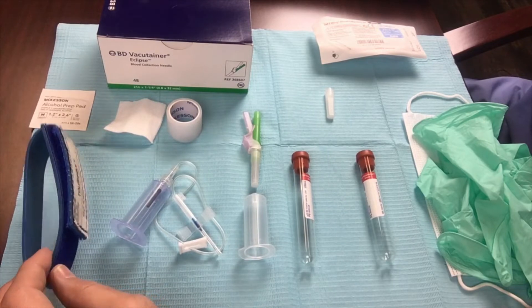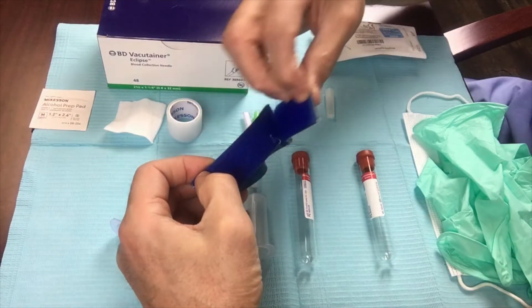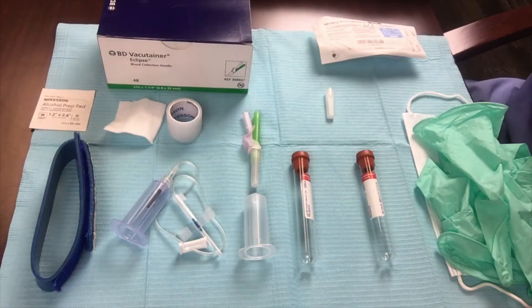The first thing I want to discuss is a tourniquet — a latex-free tourniquet. I use one that has a velcro strap. It secures nicely around the patient's arm. It comes in various sizes: extra large, large, medium, and small. So you can have that on hand.